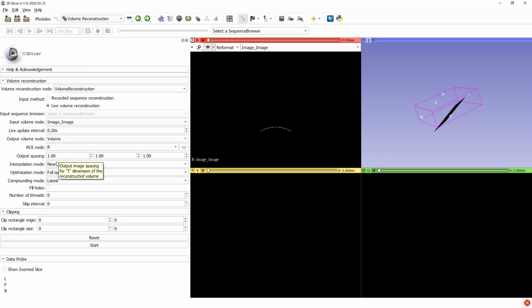Now we can select the region of interest we've just created. We'll use linear interpolation for volume reconstruction. And usually for ultrasound, we use the maximum compounding mode.